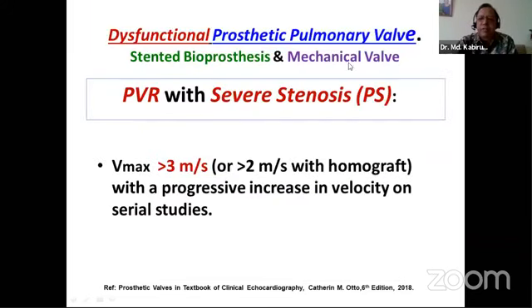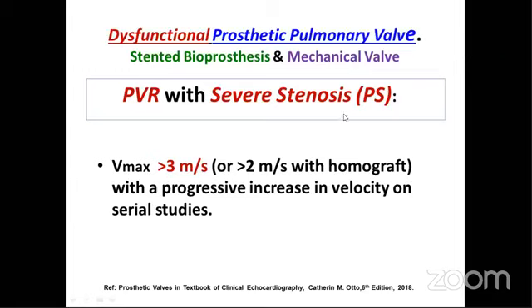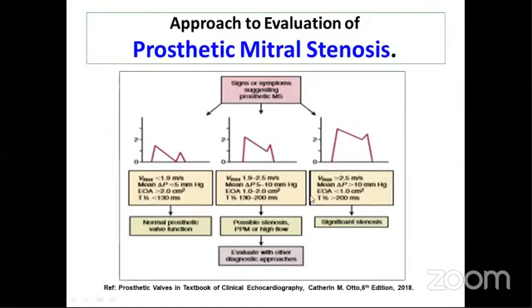Regarding the prosthetic pulmonary valve. Dr. Kabiruzzaman, sir, can you explain the previous slide? Take some minutes. The algorithm. Can you explain this algorithm just for 2 or 3 minutes?